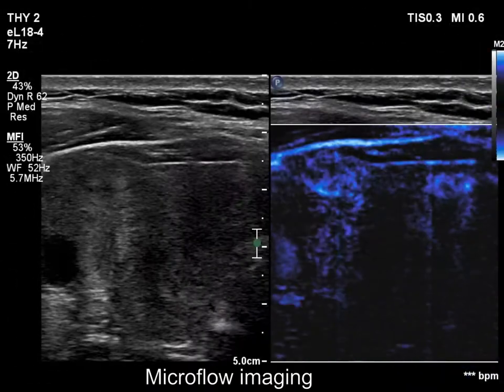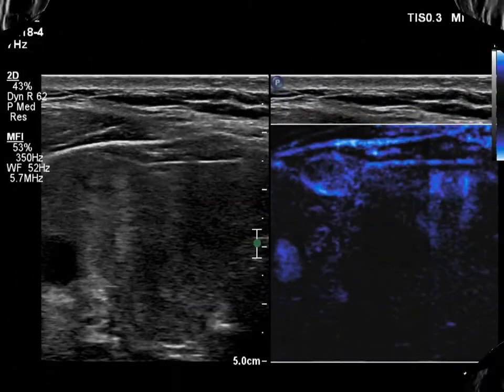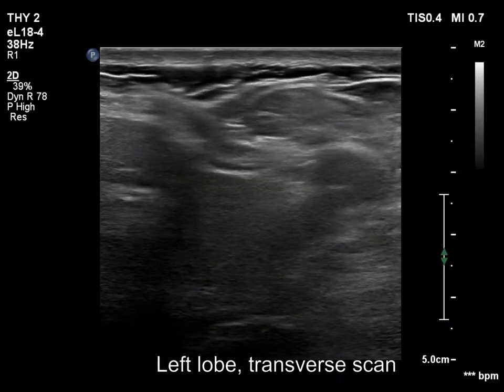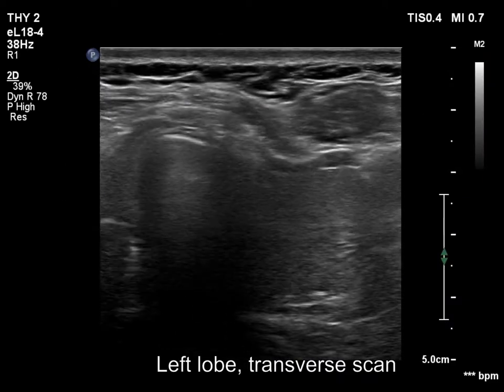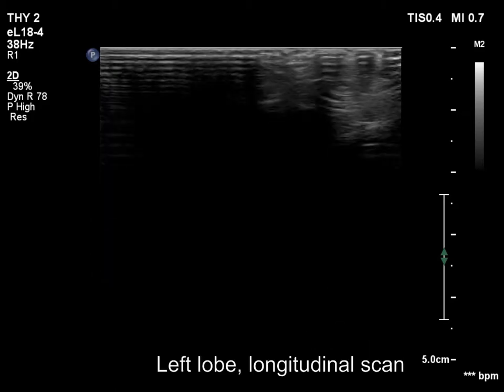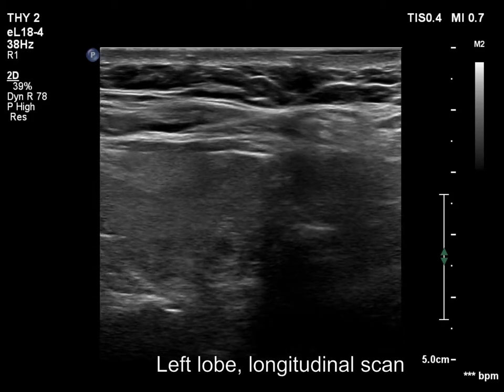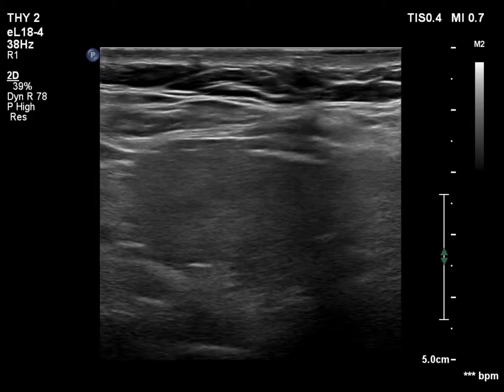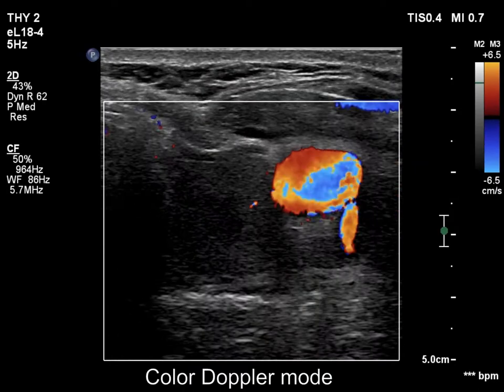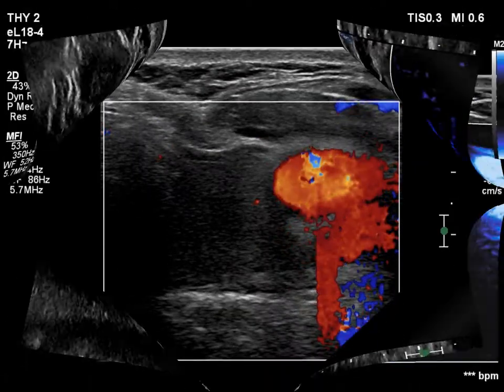Microflow imaging is less influenced by this effect. The left lobe is decreased in size. Here we can see another effect: the pulsating of the carotid artery causes artifacts.